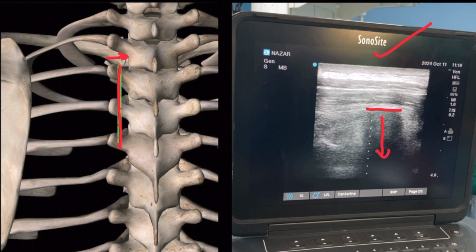So at the level of the ribs in the costal view, you will see a curvilinear round hyperechoic line, while at the level of the transverse process, you will see a flat hyperechoic line with the acoustic shadow. One more thing, in the transverse view the pleura will not be visualized, and here you see skin, subcutaneous tissue, and trapezius, rhomboid, and erector spinae muscle.